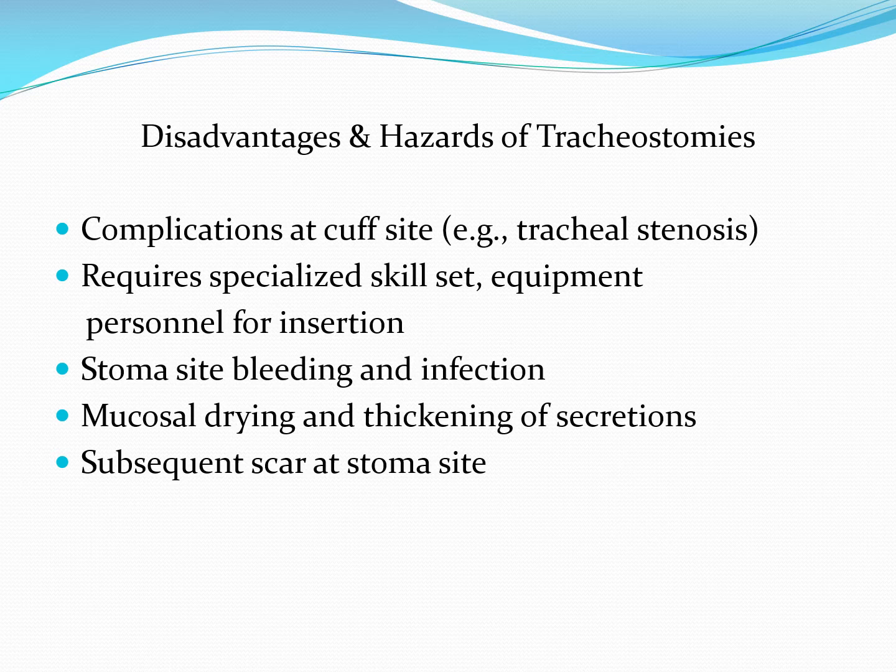In addition, it requires specialized skill set, equipment, and personnel. So it's not something we do casually. It's something, particularly when patients are being converted from an endotracheal tube to a tracheostomy tube, that's a process. It requires special skills and equipment. Stoma site bleeding and infection is another concern.